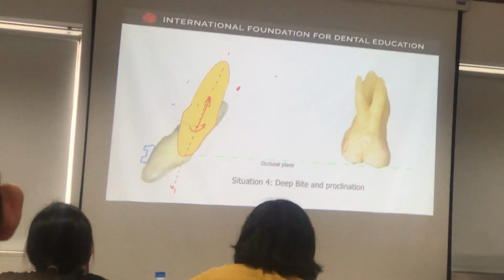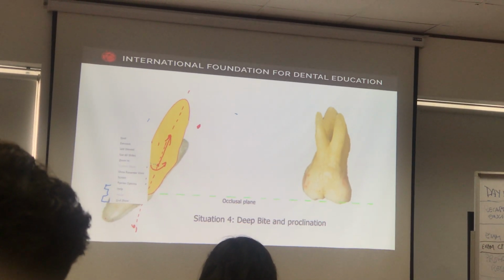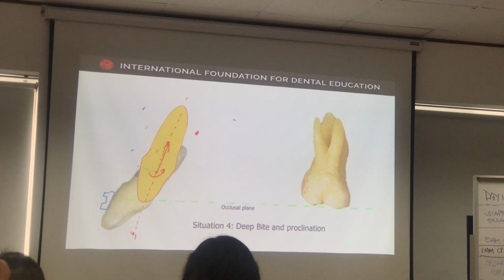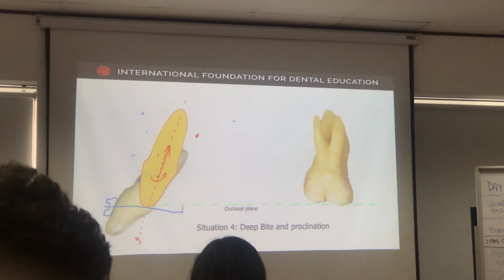So what you do, you put a piece of wire, and this is very simple to do. This is what I find very funny because people say segmented is so complicated. It's so simple. I mean, some segment is very complicated, but this is simple stuff. So what I'm doing is this. Chúng ta thấy là cái cơ chế phân đoạn thì có nhiều cái rất là phức tạp, nhưng mà để drawing chúng ta dùng cái đơn giản thôi.